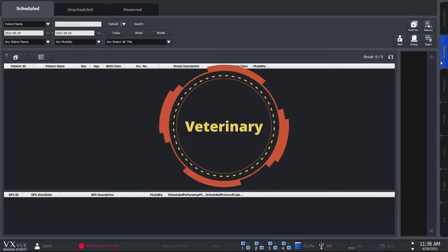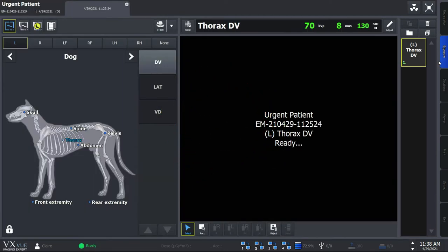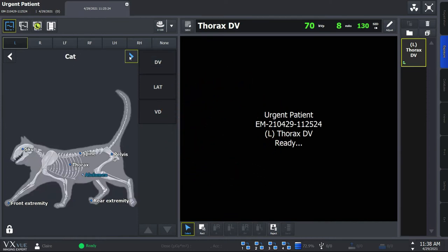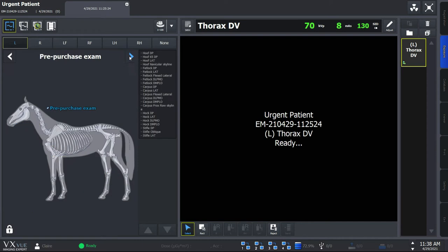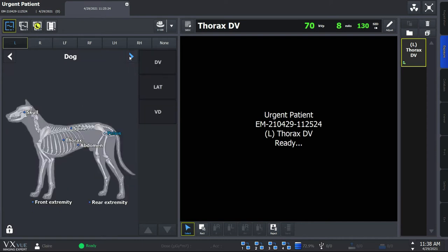Let's first look into the veterinary application, which can be divided into Vet and Equine modes. Vet mode supports diverse animal species from cats and dogs to exotic animals. VueWorks understands animal sizes can vary largely depending on their species. VXVue, being a software solution, can accommodate all sizes with unlimited APR. We have Vet-exclusive features such as veterinary measurement tools, special DICOM tags, and body part and projection.